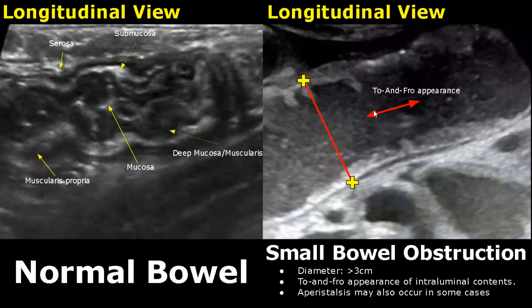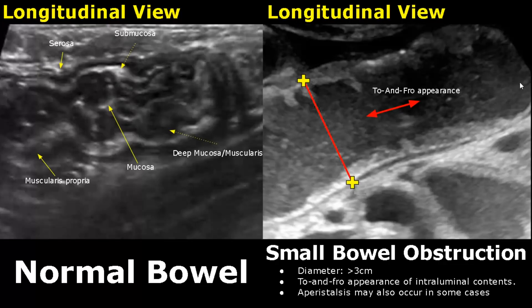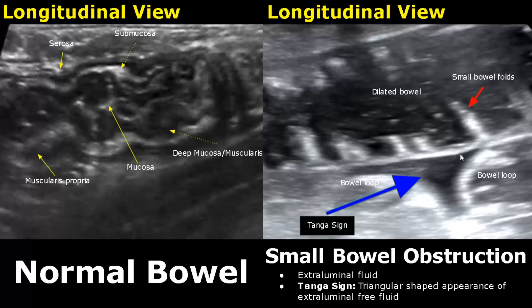Another feature of obstruction is the to-and-fro appearance of intraluminal contents. In the live video, you will see these contents moving back and forth inside the bowel in bowel obstruction. Absence of peristaltic movements may also be seen in some cases.